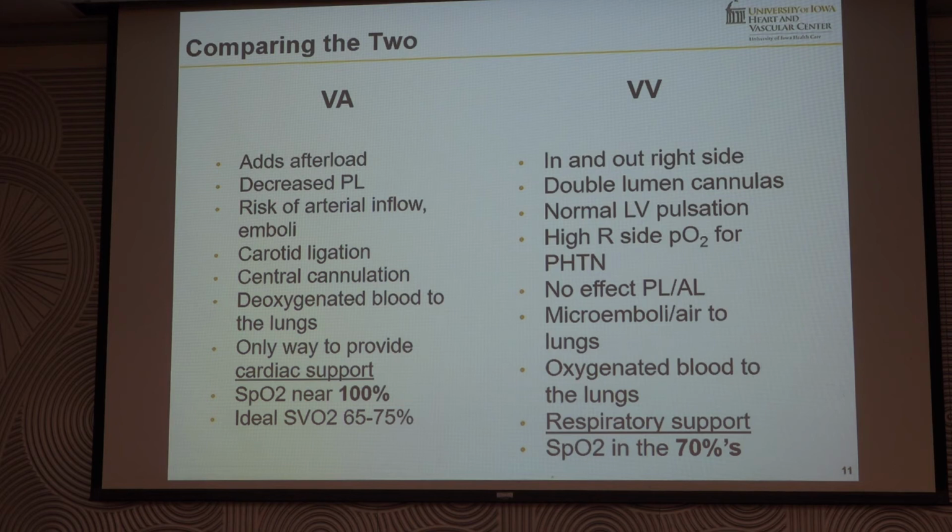And you can do central cannulation with this. Sometimes our patients will come back from cardiac surgery with the perfusion cannulas still open chest, and we'll just hook our ECMO pump up to that.